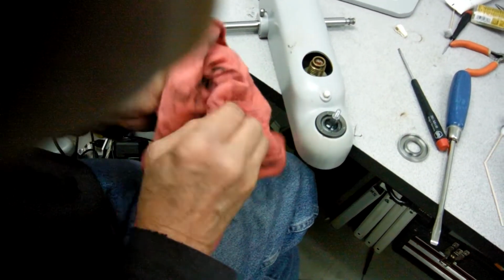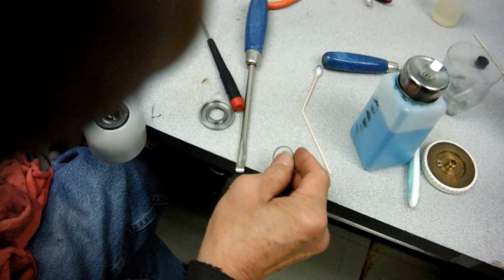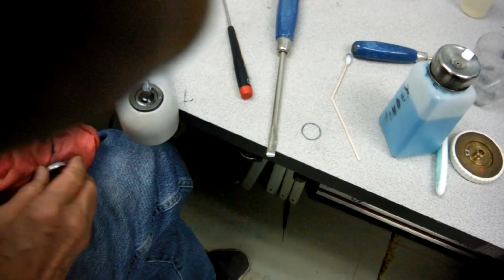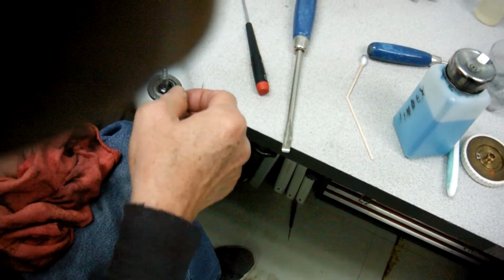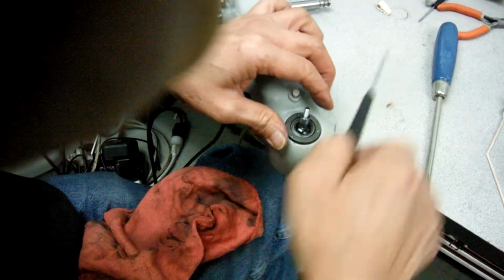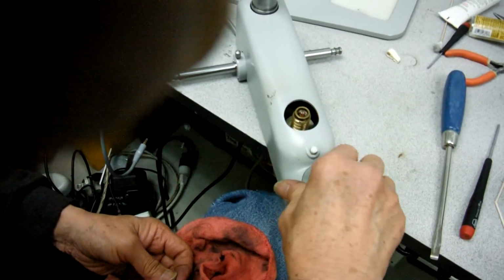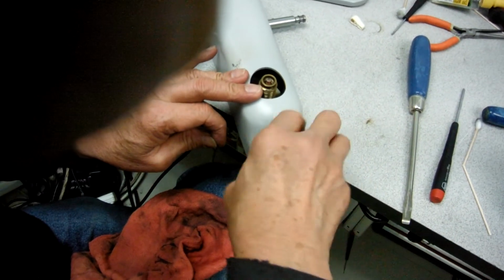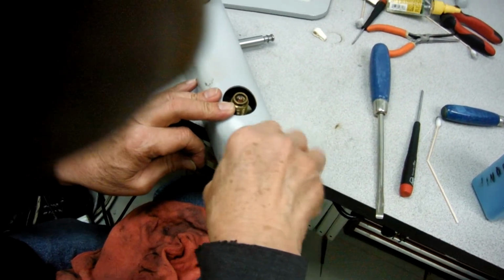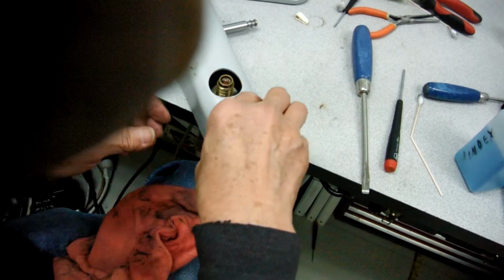Now this ring right here, some of the bases will have it, some of them don't, so don't worry about it if you don't have it. It looks like this one is here because sometimes some of the parts wore out, so they put this one in there to get more pressure that sits on top of that. So when this one goes down there, it creates the pressure on the ball, because without this piece, you might not be able to lock the ball completely. See, right now it's still loose, and I already ran it all the way in there, still loose, and that's why they have this washer to shim in there to hold it in place.